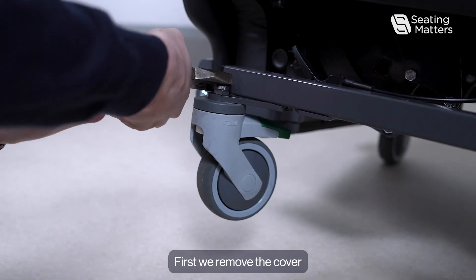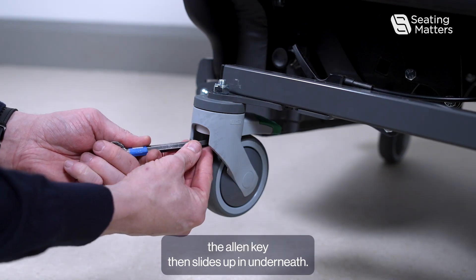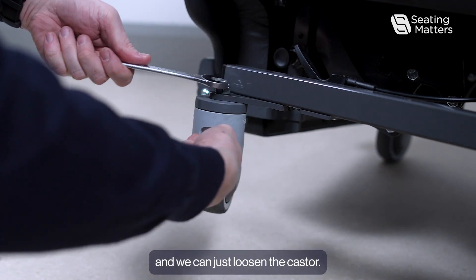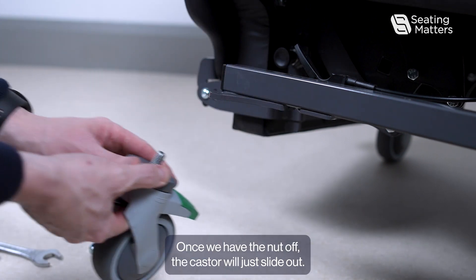First we remove the cover. The allen key then slides up in underneath. Once the allen key is in, the spanner goes on and we can just loosen the caster up. Once we have the nut off, the caster will just slide out.